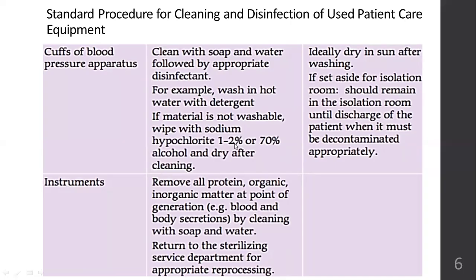You can't send blood stained, body fluid stained, dirty equipment with all the organic matter on it as it is to the CSSD. It has to be manually cleaned at the point of generation, and then sent for reprocessing. So far, is it clear to all?